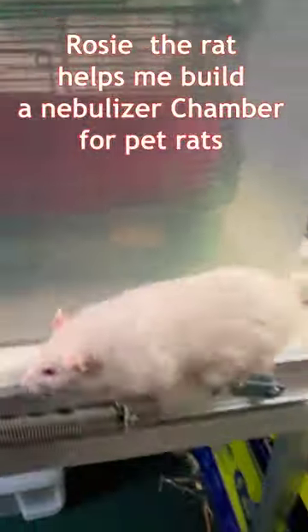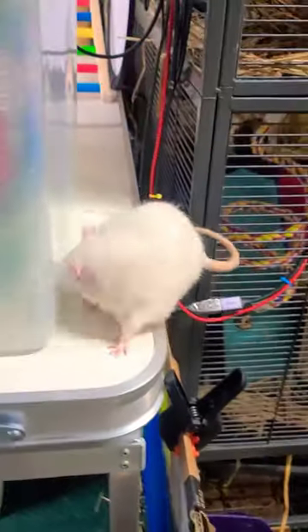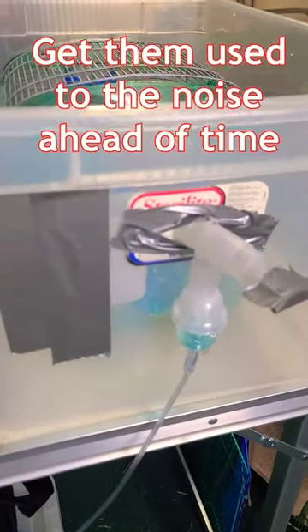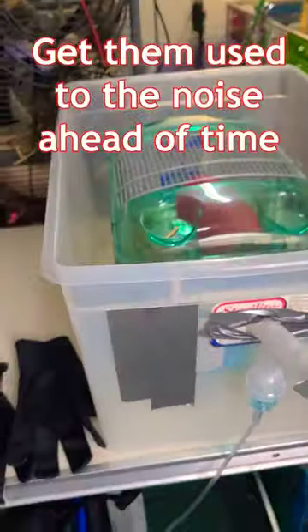This is Rosie. She's helping me build a nebulizer chamber for pet rats. This is Rosie's first test in the chamber — getting her used to the noise ahead of time.